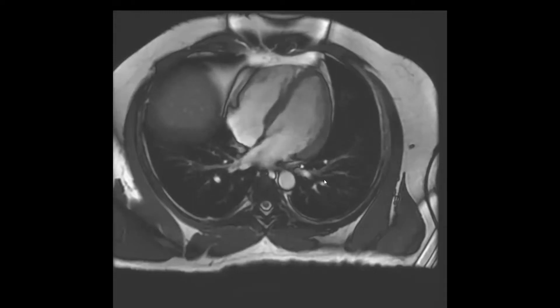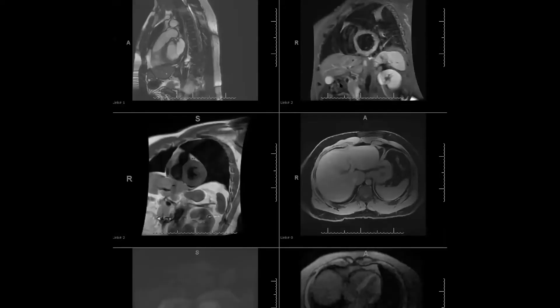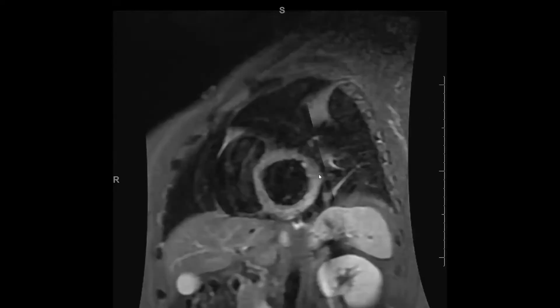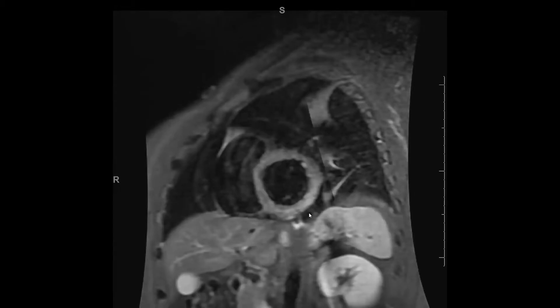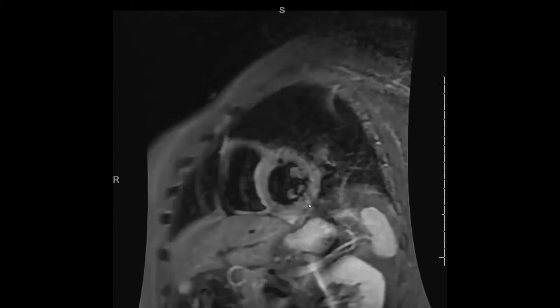Here is the short axis STIR T2 image, and we see abnormal T2 signal in the inferior, inferolateral, and lateral wall of the LV at the base. These slices are 10 millimeters thick, and we see abnormal T2 signal on at least two slices — that's at least 20 millimeters of LV involvement — a pretty large chunk of abnormal signal, whether it's edema or inflammation within the LV myocardium.